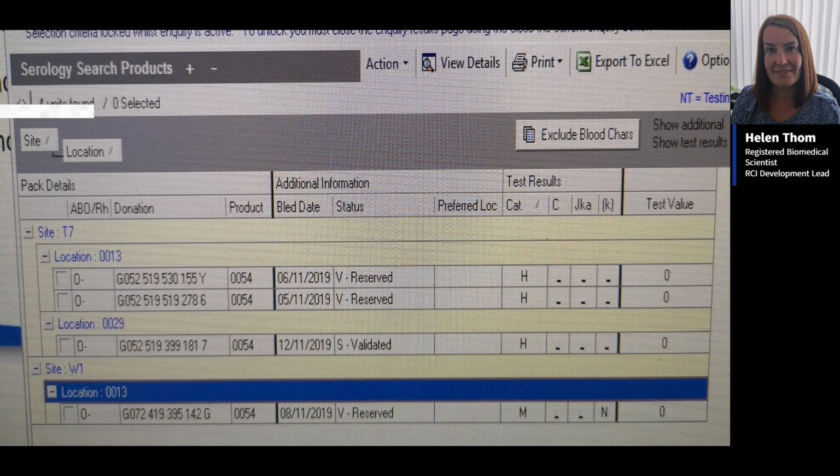So the patient didn't have to wait to be transfused. With this patient, they wanted the blood for the next day. There are different codes on here as well, so we'll know what the internal location codes mean, and these were both in London. This patient was in Newcastle, so I got in touch with hospital services and said, can you order me 2 of these units to come up overnight on one of our runs, so I can get the blood to this patient in the morning.